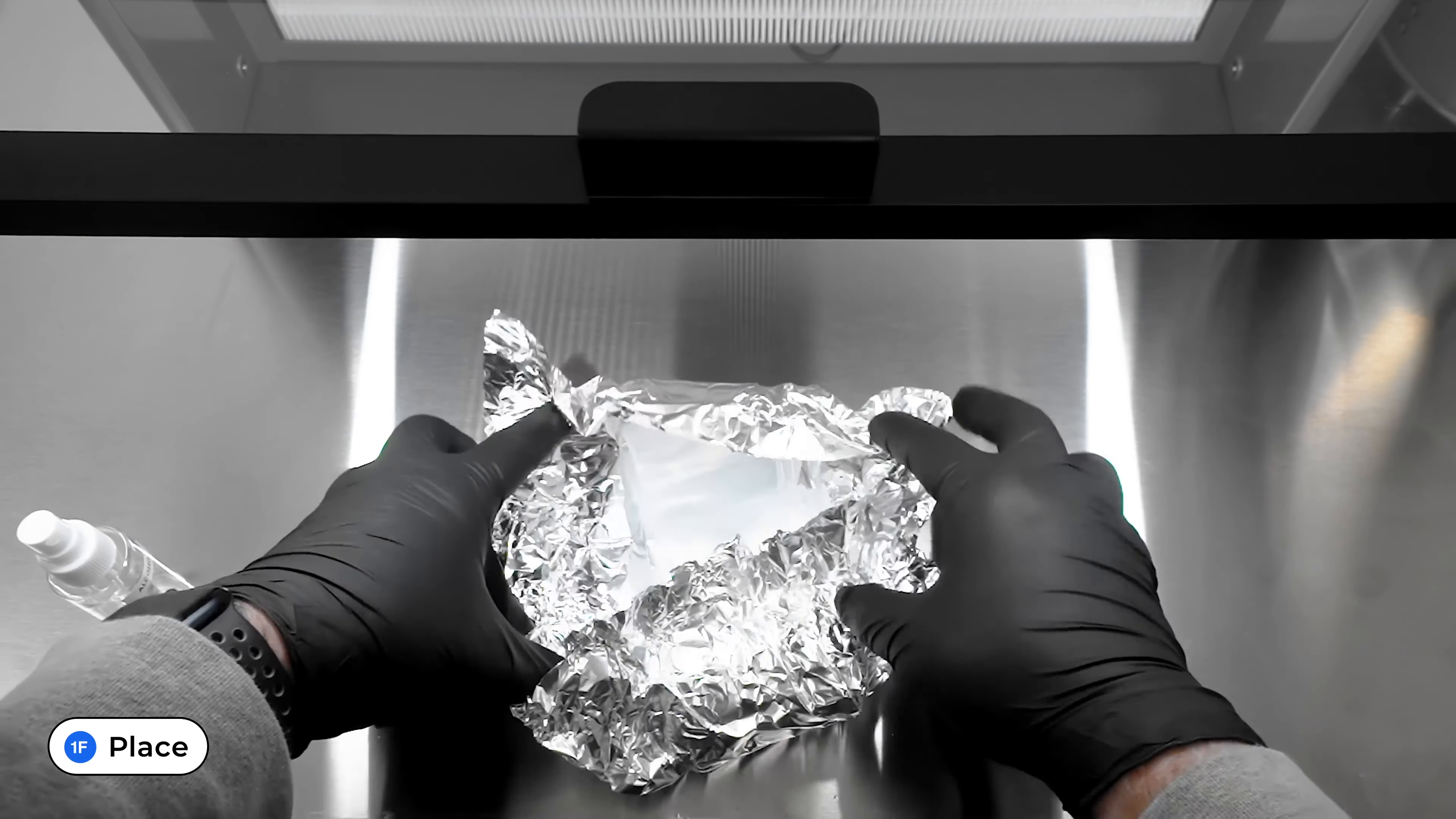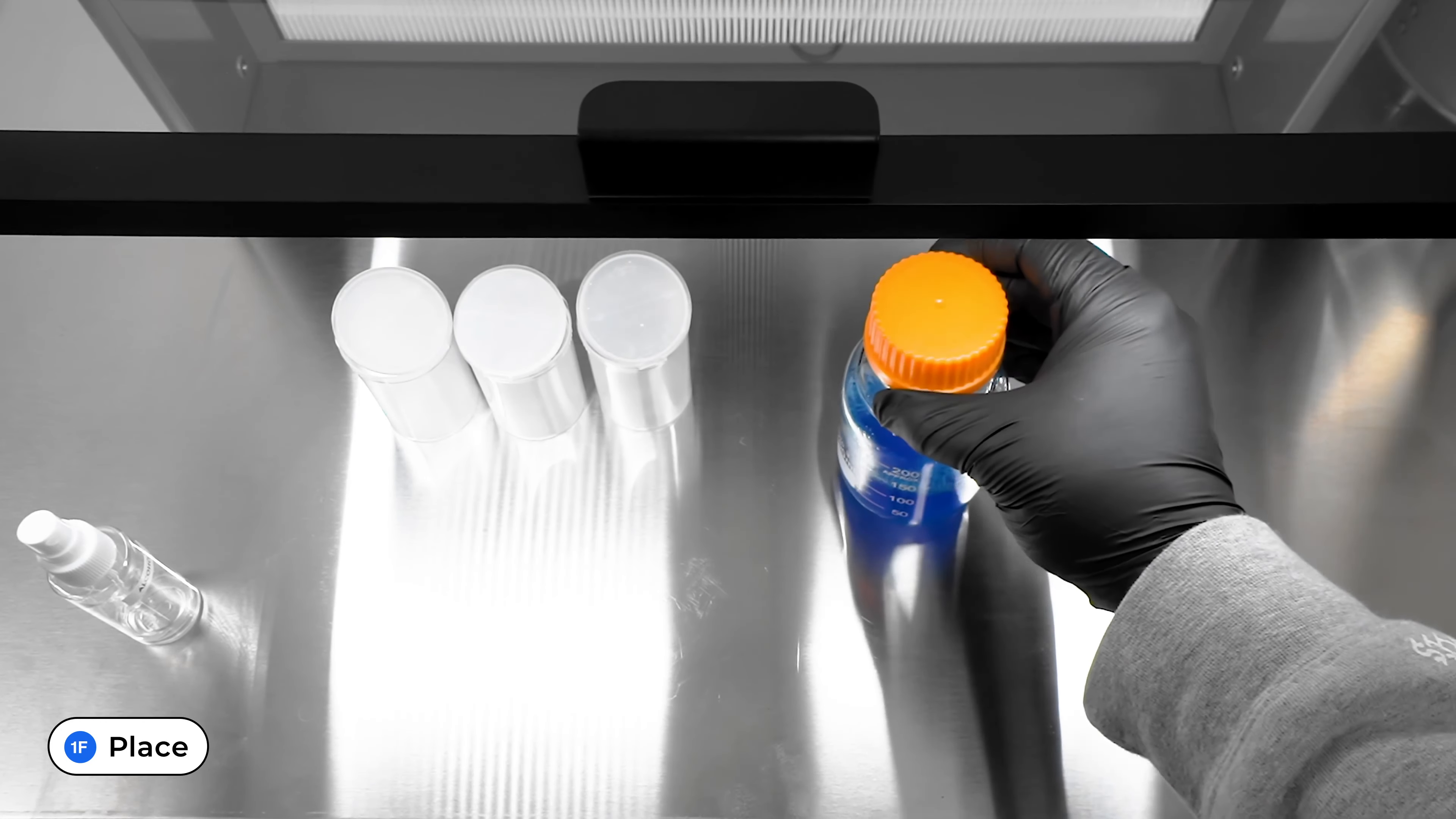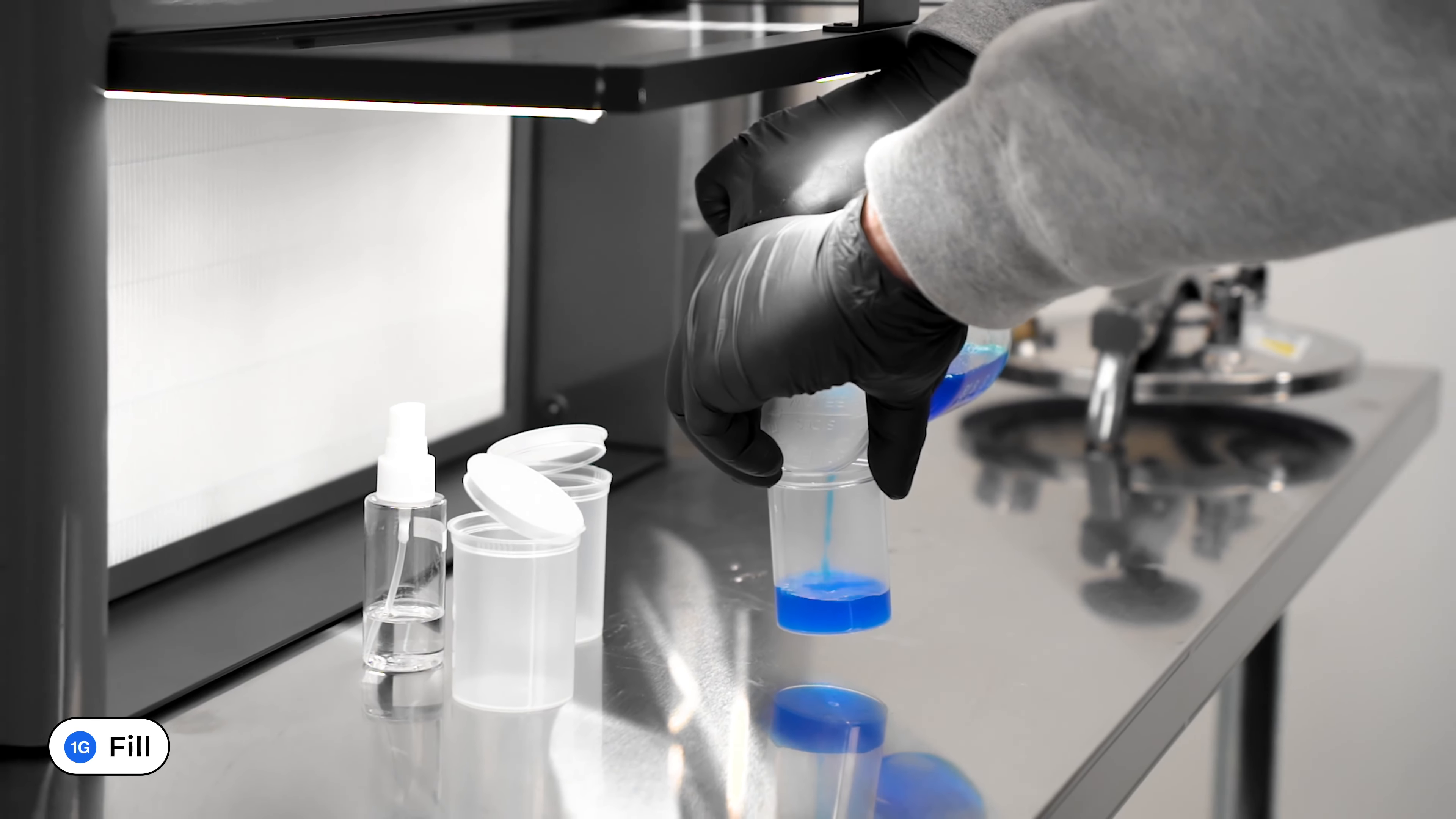Place the items from the autoclave directly into the work zone and allow them to cool enough to handle, usually around 100 to 110 degrees Fahrenheit. Fill each culture vessel one quarter full before the solution hardens to a gel.